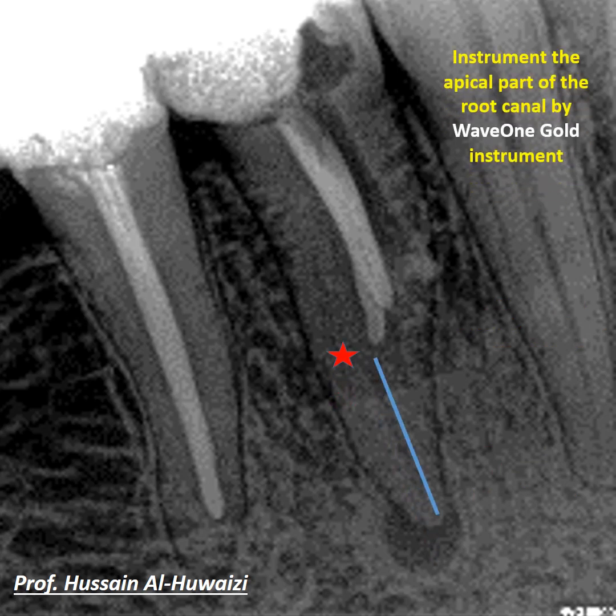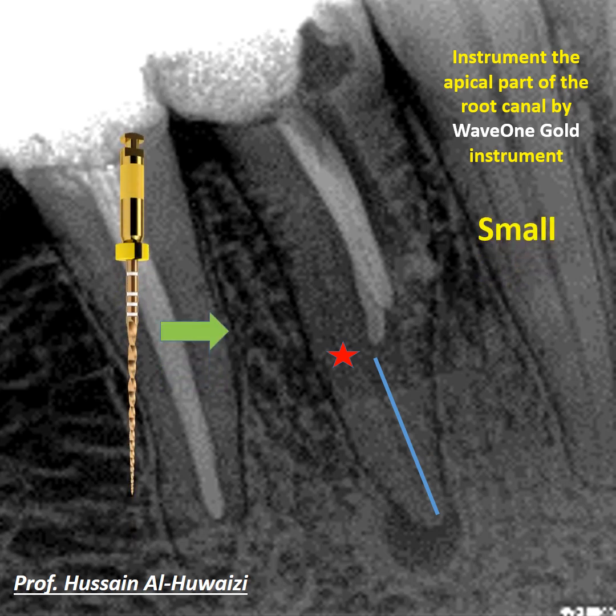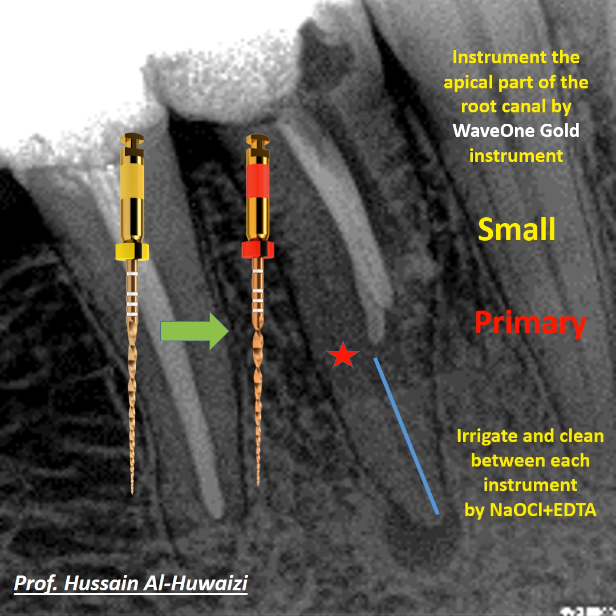Instrumentation of the apical part of the root canal was performed using the WaveOne Gold instrument — first with the small WaveOne Gold to ensure the canal was wide enough, then with the primary WaveOne Gold. Between each instrument, the canal was irrigated and cleaned with sodium hypochlorite and EDTA.